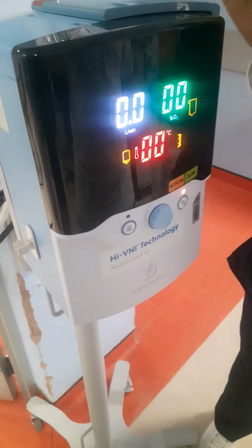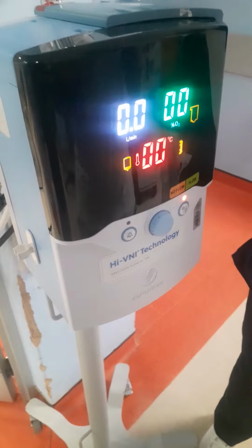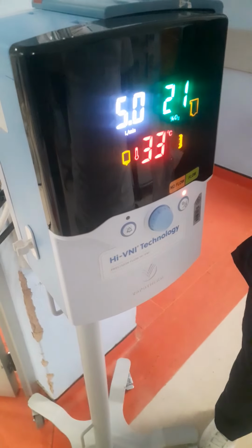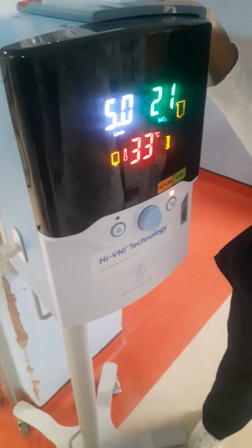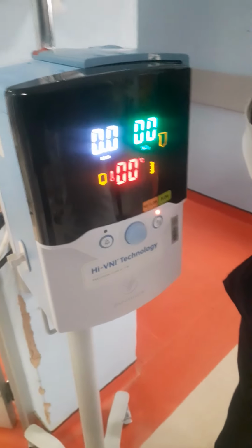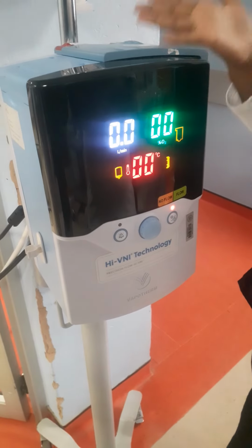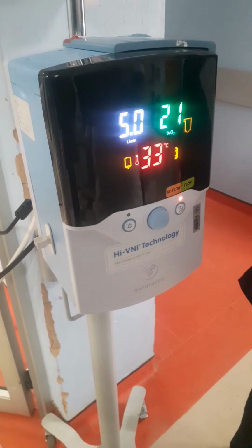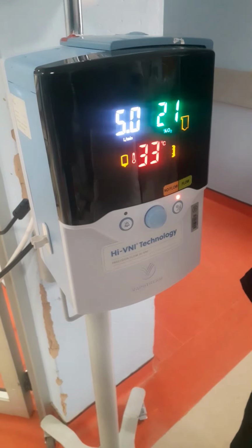What the warm air will do is like when you steam yourself: it's like you're opening everywhere. That's what high flow is like, it's like they're putting steam through your nose. Now your secretions get loosened and then they come out. Some patients actually want to wipe their nose because it will be dripping out. Then the lungs are opening up.